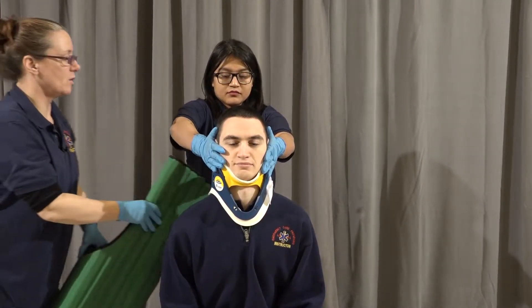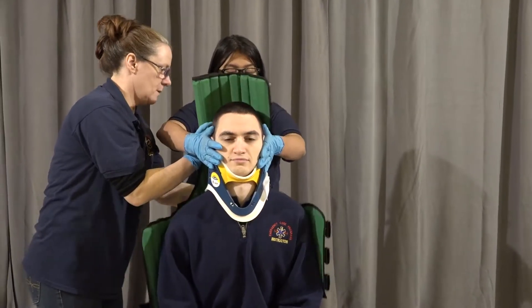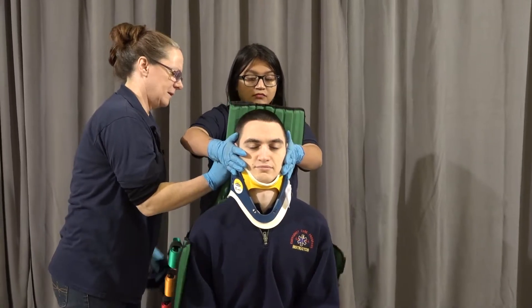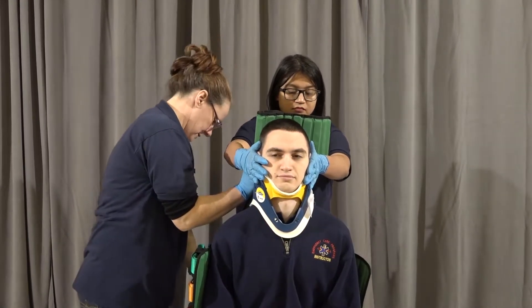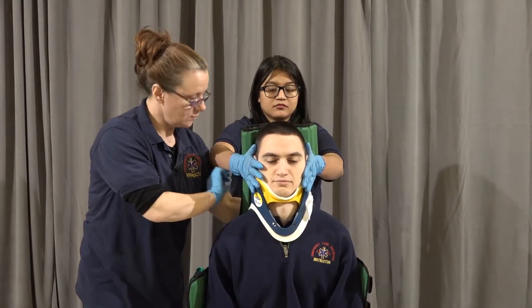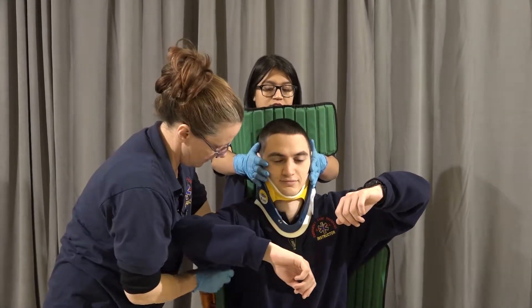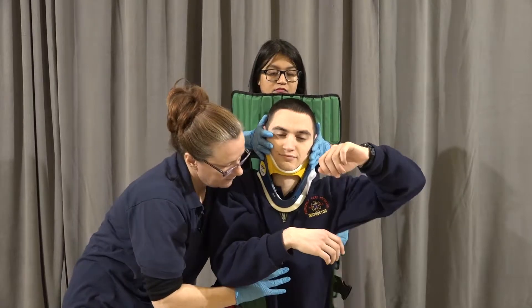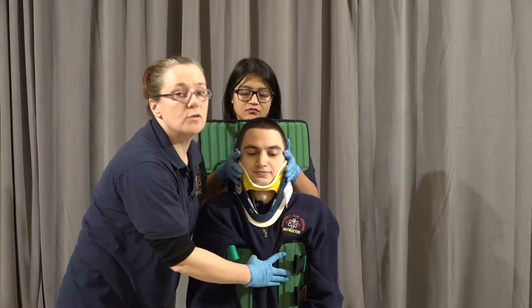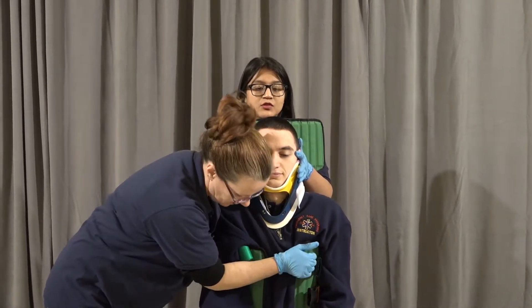I'm going to bring the device in under my partner's arms, open it up, and release the leg straps. This patient is stable so you can ask them to assist — can you lift up your arms for me please? We're going to make sure it's centered and then move the patient back into their original position, again on the head's count: one, two, three.